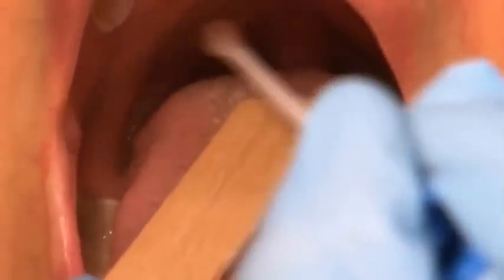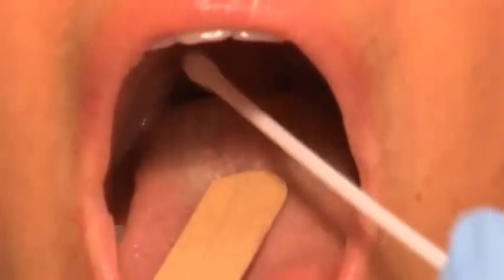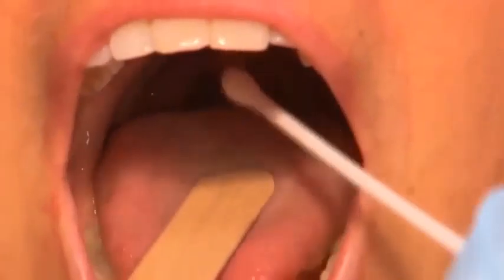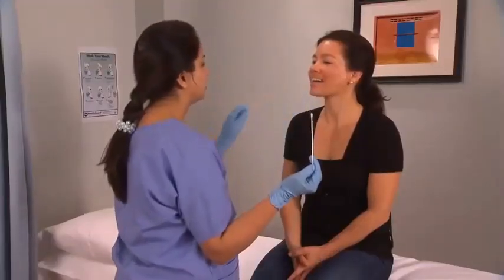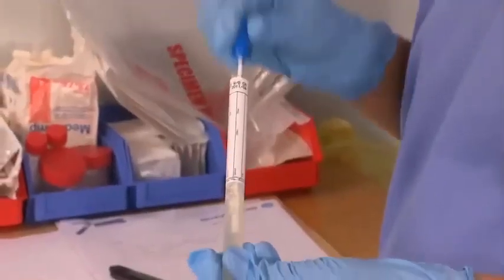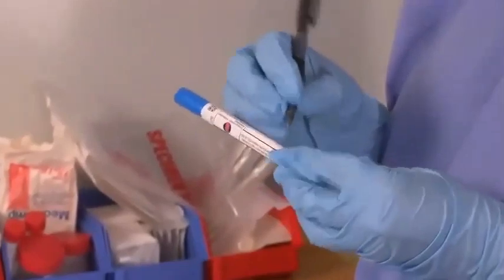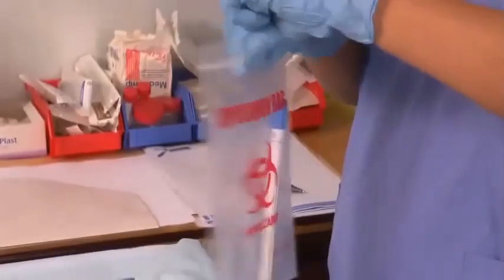Gently swab between the tonsillar pillars and the tonsils. Include any inflamed or purulent areas. Withdraw the swab without touching other structures, then remove the tongue depressor. Place the swab in the transport medium, label it, and place it in the transport bag.